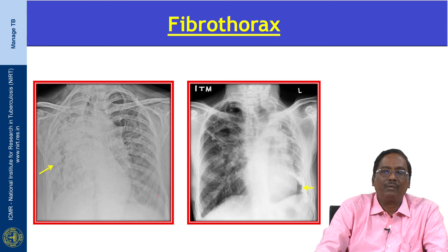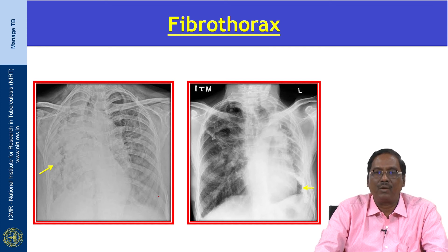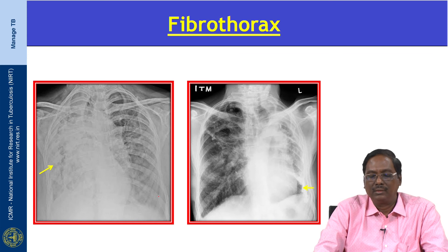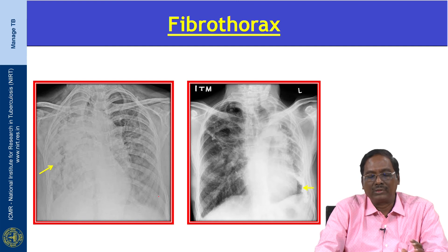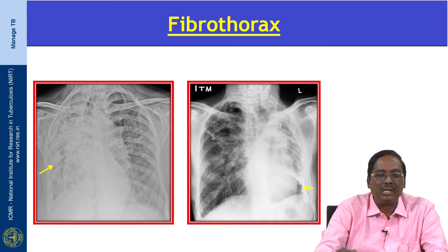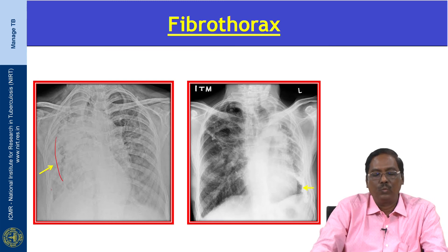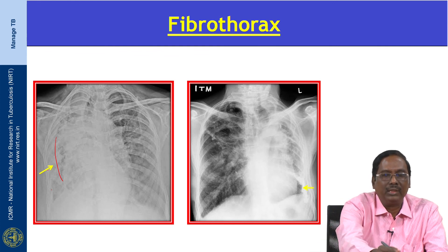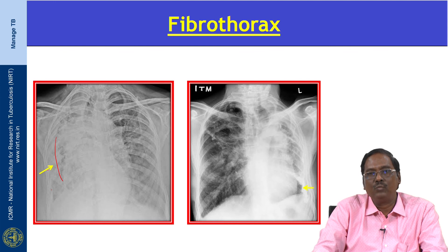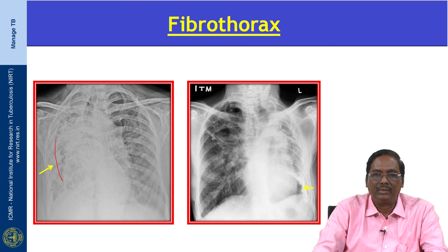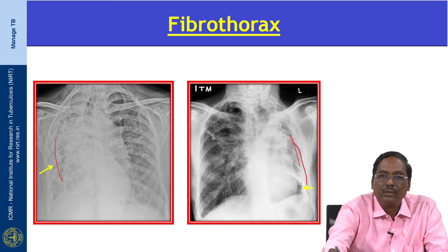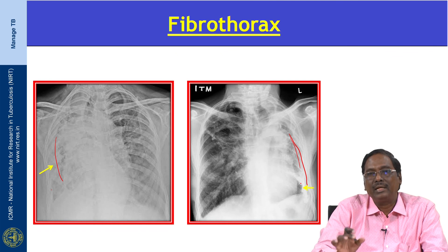This x-ray shows fibrothorax, the most severe form of pleural fibrosis. There is extensive damage to the visceral pleura — it is completely thickened, with fusion of both visceral and parietal pleura, obliterating the pleural space. The mediastinum is shifted to the same side, with marked volume loss on the affected hemithorax and reduced lung mobility.